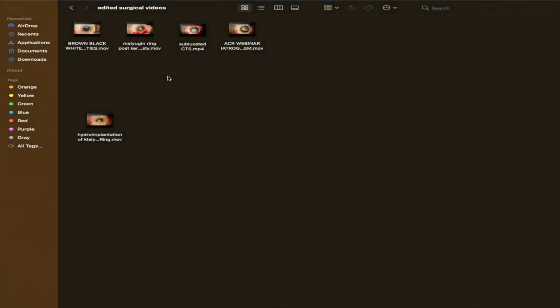So this kind of scar is not in the visual axis. If the vision is not improving because of the scar, it's because of an irregular astigmatism induced by the scar. So you have to look at the topography, and after 3 months or so, once the edema and everything has settled down, I would do a topography guided laser to regularize the shape of the cornea. In this particular case, thankfully I didn't need to do much. After removing the sutures, his vision was pretty good.